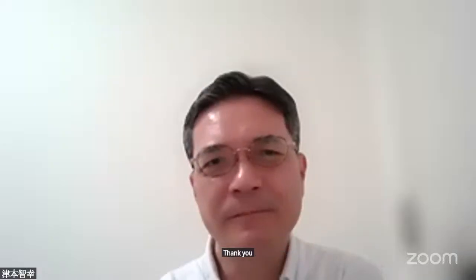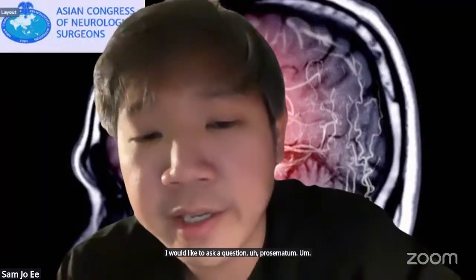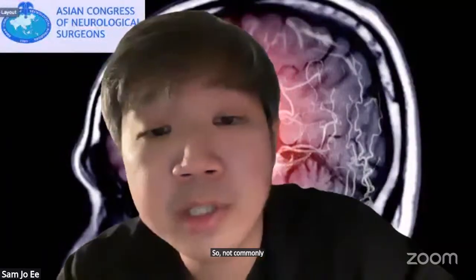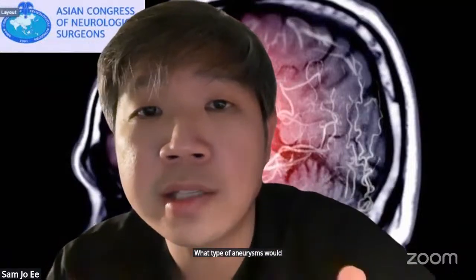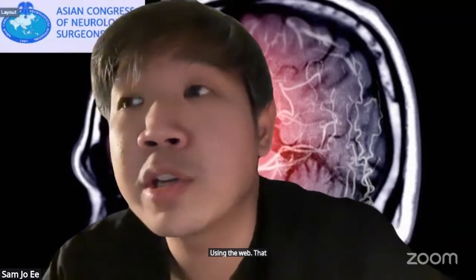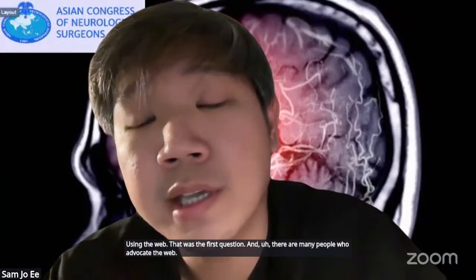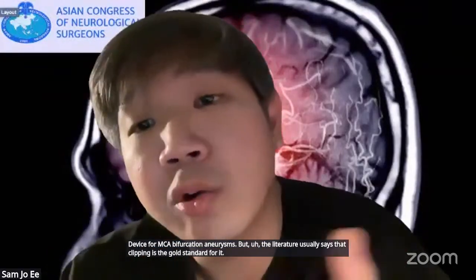I would like to ask a question, Prof. Tsumoto. I think web devices and intrasaccular devices are not commonly available, especially where I am here in Malaysia. What type of aneurysms would you suggest as a beginning type of aneurysm to start off using the web? That was the first question. And there are many people who advocate the web device for MCA bifurcation aneurysms. But the literature usually says that clipping is the gold standard for it. What are your opinions on that?